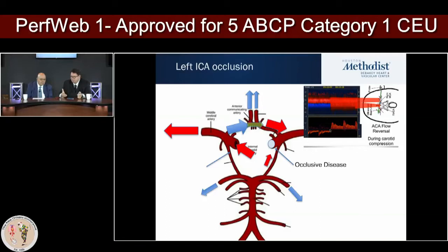For example, if you're cannulating just the axillary artery, you expect to see bilateral MCA flow. But if your circle of Willis is not intact, with a single cannulation site you're not going to have bilateral flow signals.